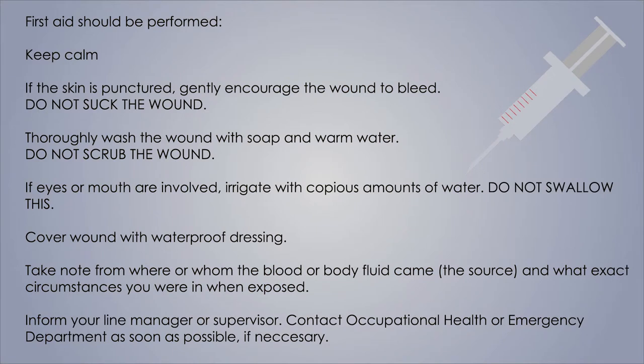Make sure that you perform appropriate first aid. Keep calm. If your skin is punctured, gently encourage the wound to bleed, but don't suck the wound. Thoroughly wash the wound with soap and water, but don't scrub it. If your eyes or mouth are involved in the incident, irrigate them with copious quantities of water, but don't swallow it.